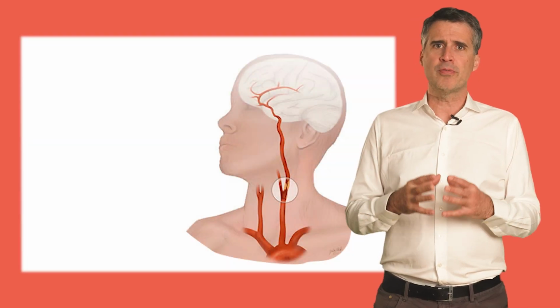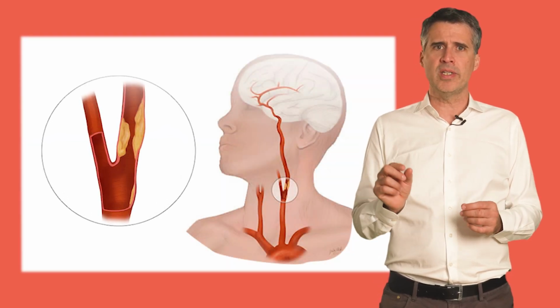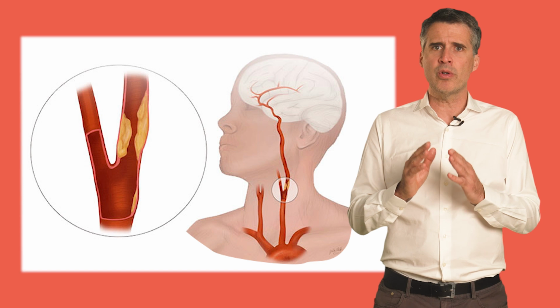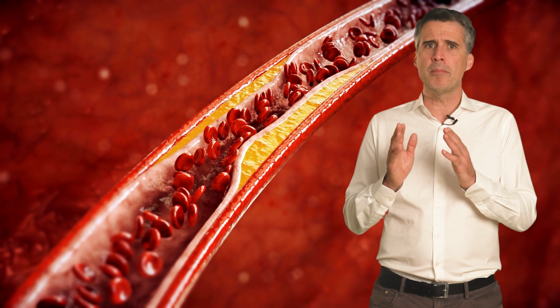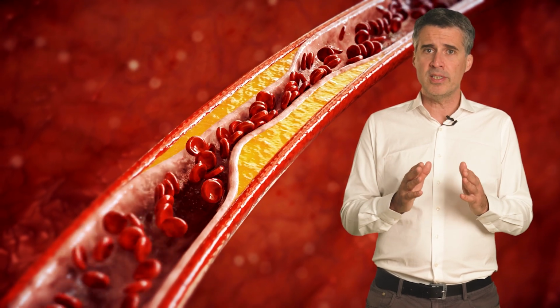If you're watching this video, it's because you have been scheduled for a cerebral arteriography, usually with the intention of placing a prosthesis or stent in one of the arteries that supplies the blood to the brain. The purpose of the stent is to widen an artery that has a passage narrower than normal, reducing the cerebral blood flow to the extent that it could potentially become completely blocked if left untreated, leading to a stroke.